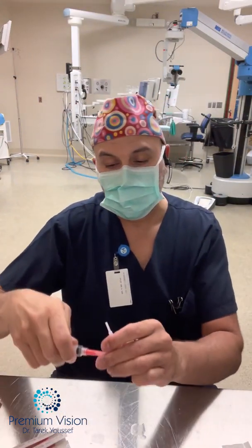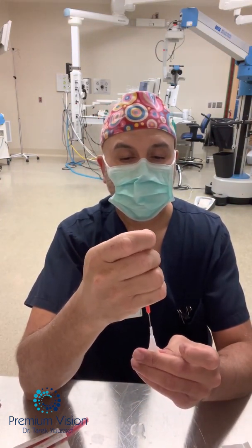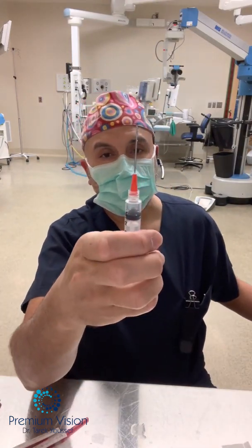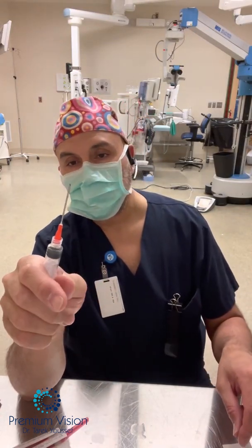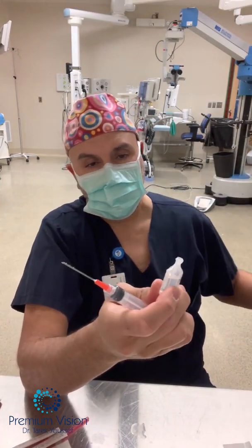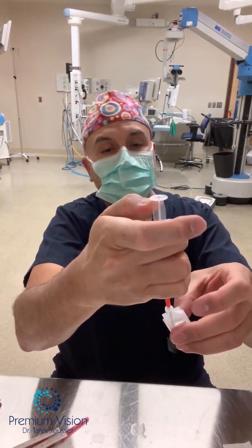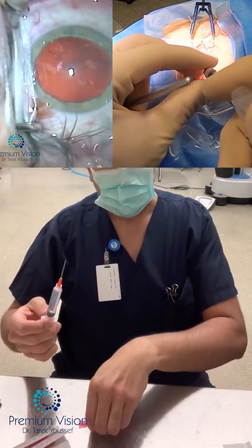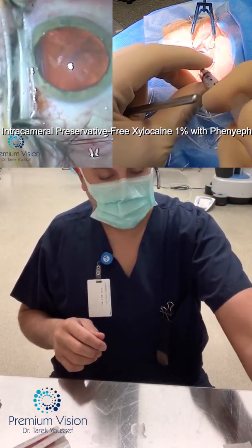Move the top of the vial, remove the cap, and slowly go into the tip while sucking, so you don't lose any drop of the phenyl-10. This is the whole vial — using the minimum. It's about 0.5ml. And this here has 5ml of 1% preservative-free xylocaine, and I'll take it all out.